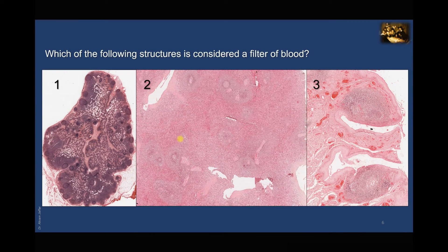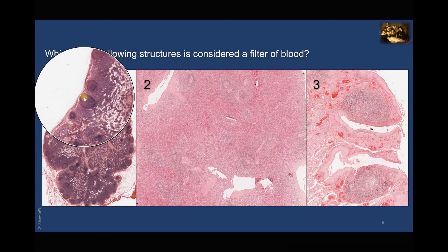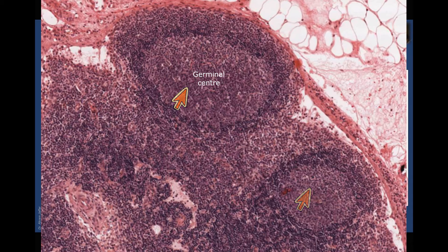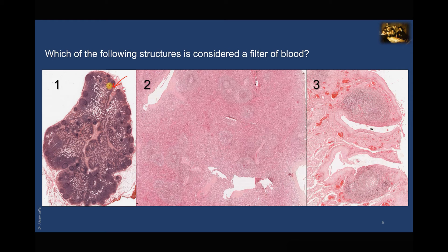Which of the following structures is considered a filter for blood? Slide one is a lymph node — you can see the fibrous capsule and surrounding fatty tissue, with a cortex containing lymphatic nodules (some showing a germinal center, indicating secondary active nodules) and a medulla with medullary cords and sinuses. It is actually the lymph node that is a filter for lymph, not for blood. It receives multiple afferent lymphatic vessels and lymphocytes in the lymph node are exposed to antigens in lymph as it flows through from afferent to efferent lymphatic vessels.